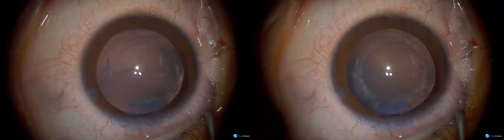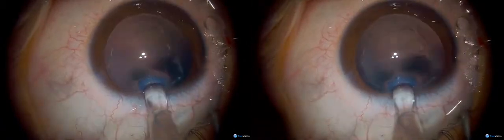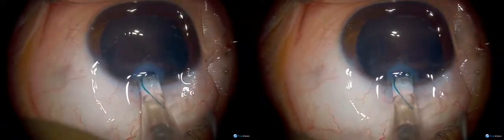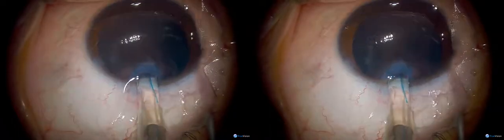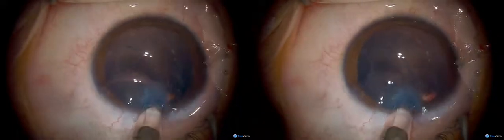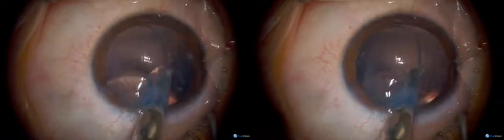You have to make sure the trailing haptic is underneath the injector. You have to try and make sure that the leading haptic is unfolded in the tip — at the moment it's curled up, and you just unfold it like that with a Sinski hook. It will make some very odd acrobatic turns as it goes into the eye, and it's a little bit of a tight fit with the C cartridge, but it usually does go. As the lens goes in you have to rotate the cartridge — so that haptic's in the bag.